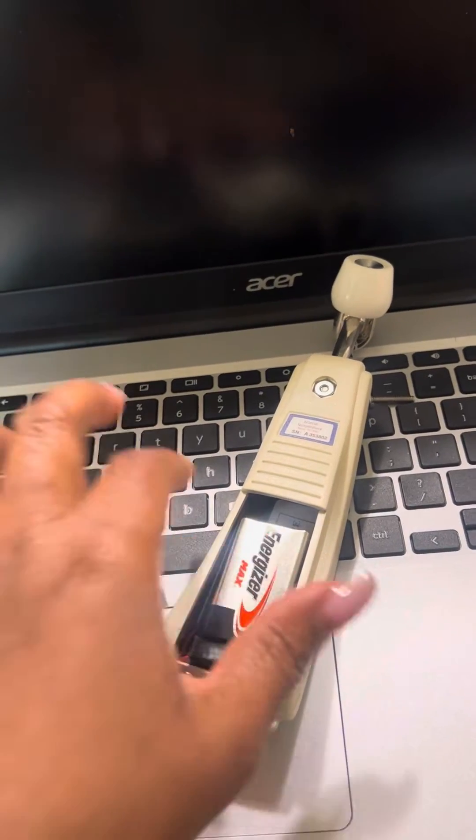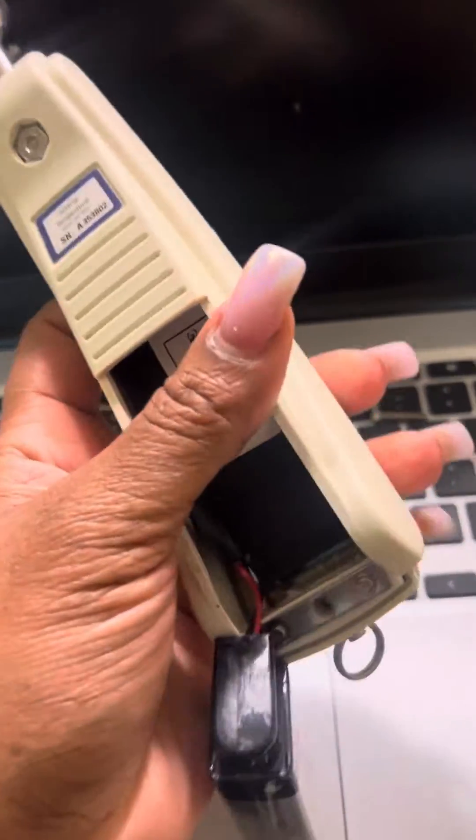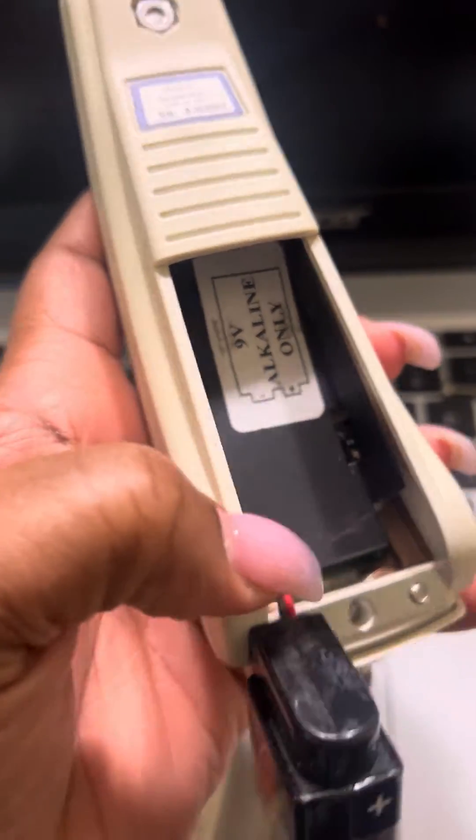Pull it down, pop the battery out. There is a button over here — I don't know if you guys can see that — on the side.